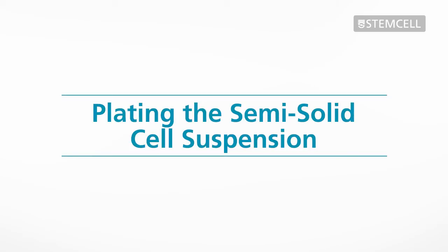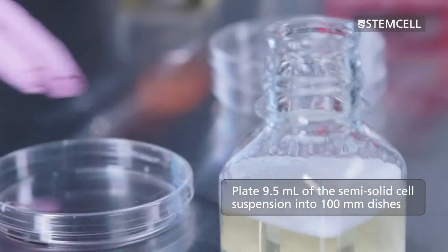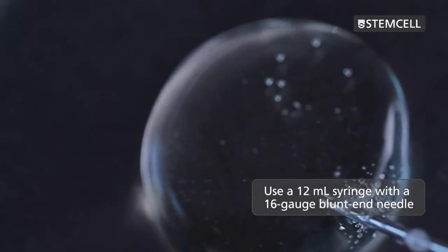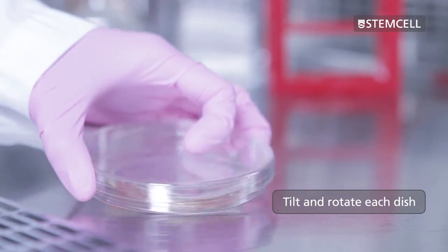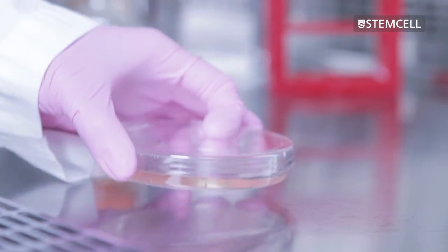Plating the semi-solid cell suspension. Aseptically plate 9.5 millilitres of the semi-solid cell suspension into 100 millimetre dishes using a 12 millilitre syringe with a 16 gauge blunt end needle. Tilt and rotate each dish to ensure that the semi-solid cell suspension is evenly distributed over the dish.